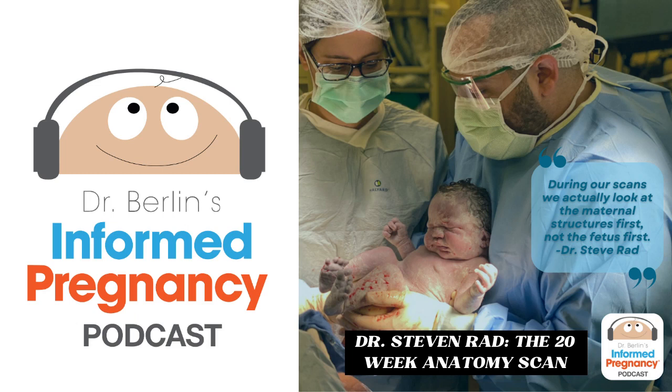Then we'll move down to the arms. We look at the upper arms or humerus. Then we look at the forearms, the radius and ulna. And then we look at the hands and we count the fingers. And then we move on. We make sure there's all the fingers and 2 hands and 2 arms, etc. And then move down and look at the baby's neck. Make sure there's no masses or abnormalities in the baby's neck or the shape or position.